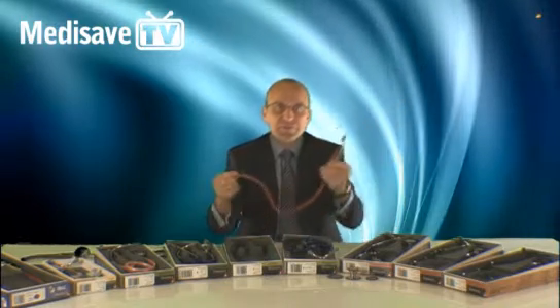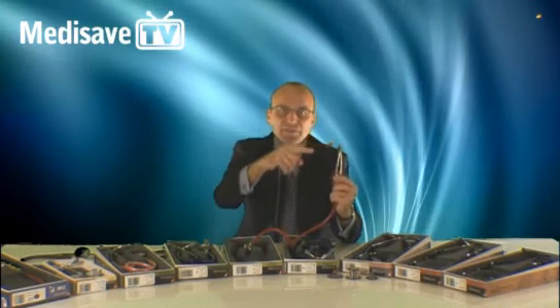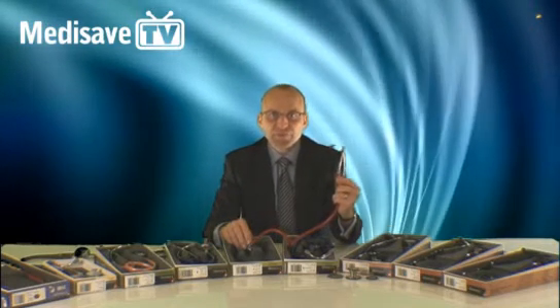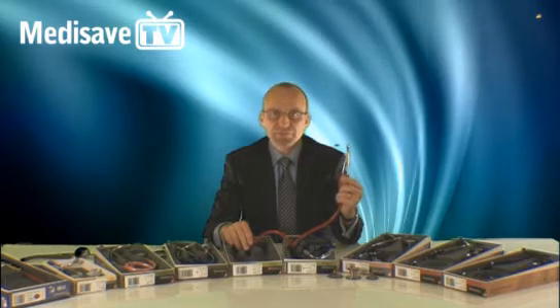The headset is also anatomically correct, which means that the eartips are pointing forward in line with the ear canals. Always wear Littman stethoscopes in this direction, with the eartips pointing forward.